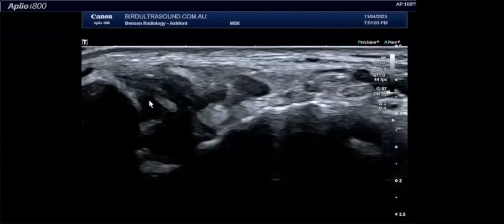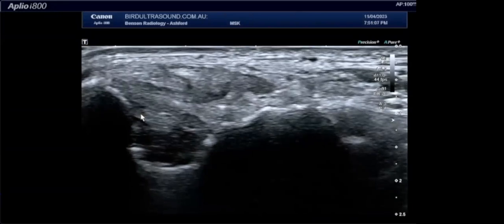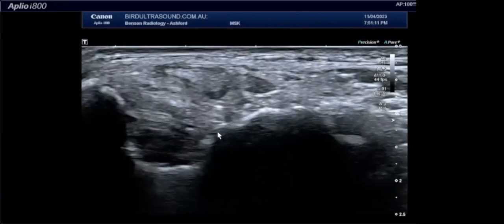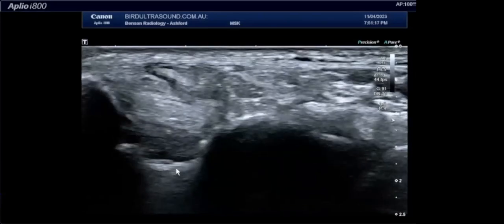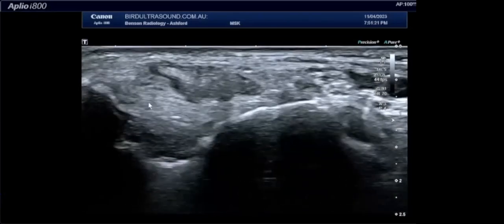So now you can see that it's actually sitting on a structure that's made of collagen. This structure that's made of collagen is not terribly attractive. This is the tibio-talar part of the deltoid ligament complex. And this is the part where we're going to have compression injuries. You can make it a little bit more attractive by using a bit of eversion and dorsiflexion. You can see as I've just put that bit of stress on the ankle there, it's tidied up those lines of collagen a bit for me.